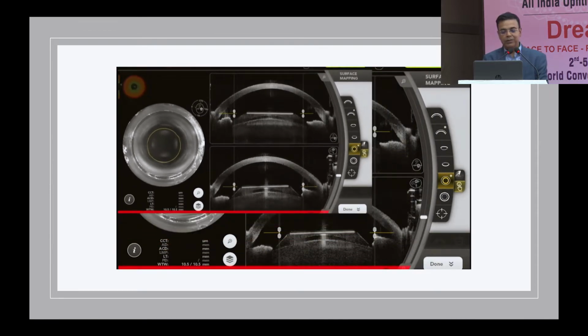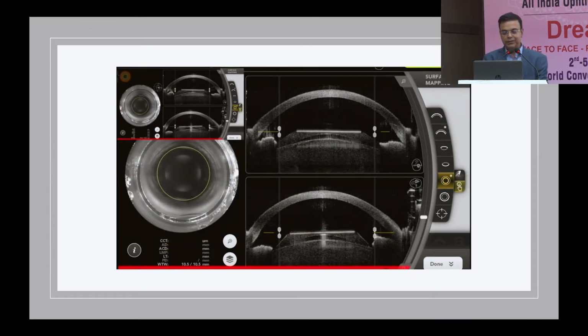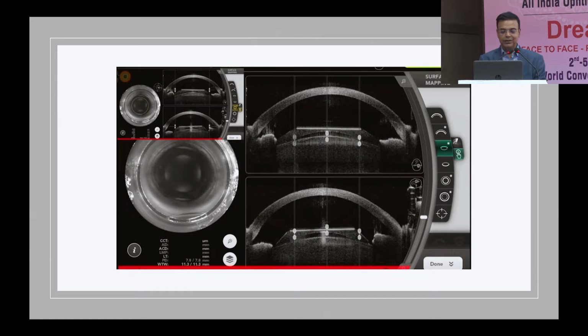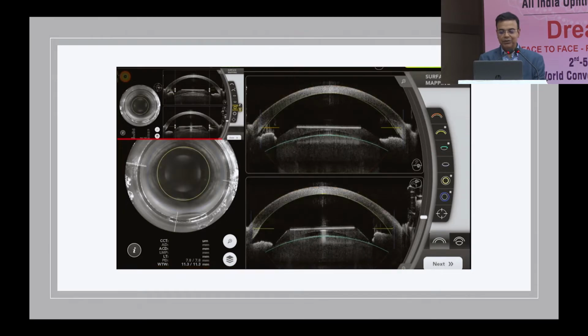And so, there was one patient where it actually picked up the limbus as the pupil and the ICL margin as the limbus. So the limbus was smaller than the size of the pupil. So I was kind of totally confused what the laser was doing. But we can't blame it because it's not meant for all these things.